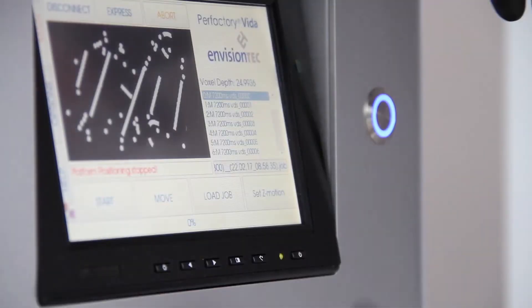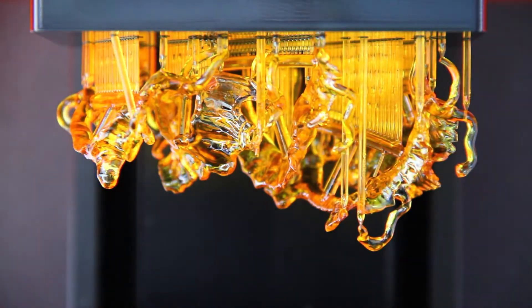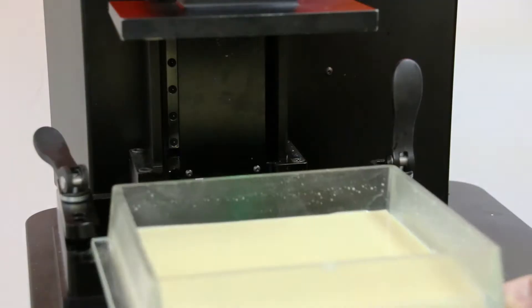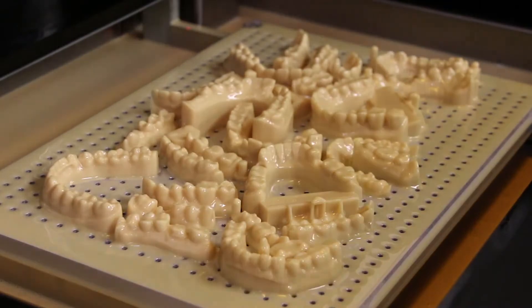I think 3D printing technology works well with the dental CAD/CAM solution because in 3D printing you don't have any limitation. Currently we have a Vida for the variety of material choice, and we also have a Vector HD for the most accurate model printing with full capacity.